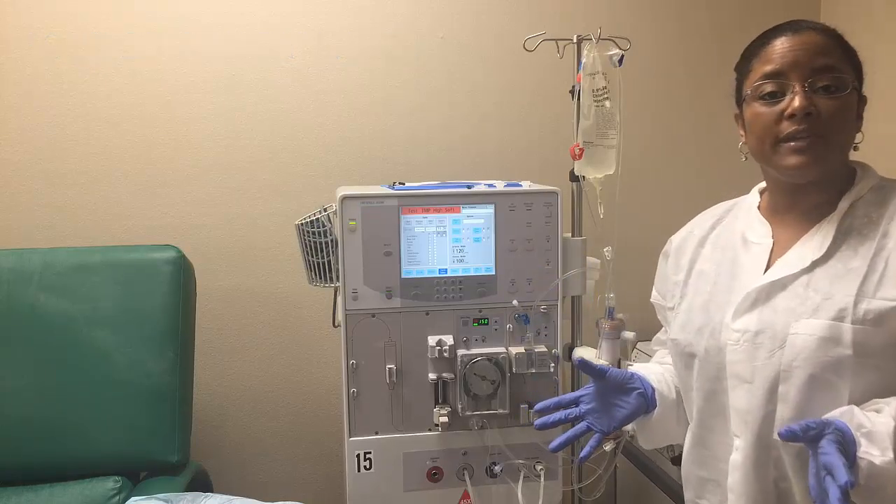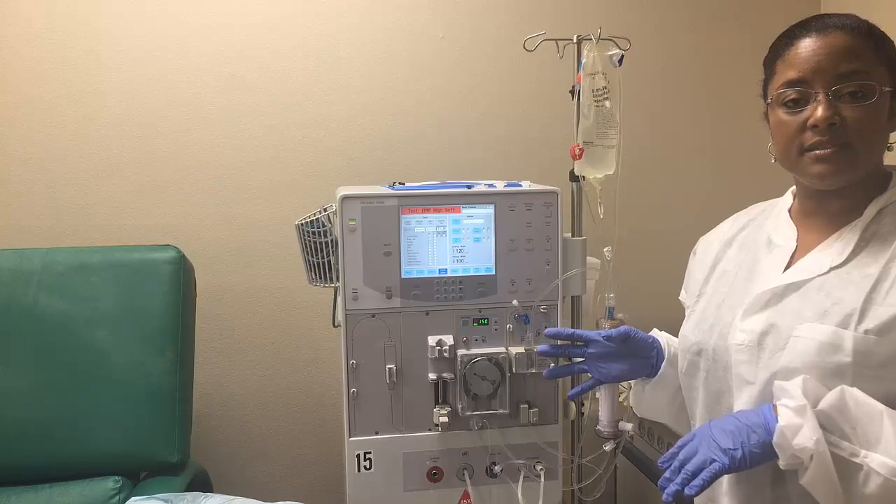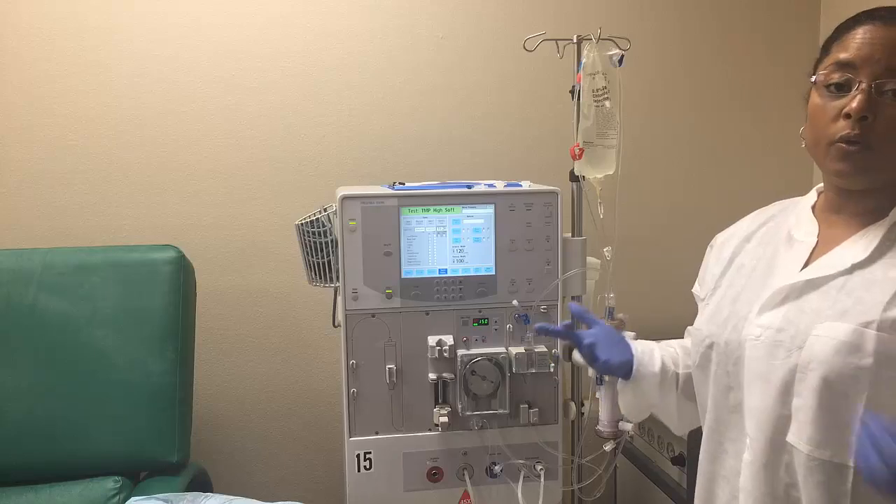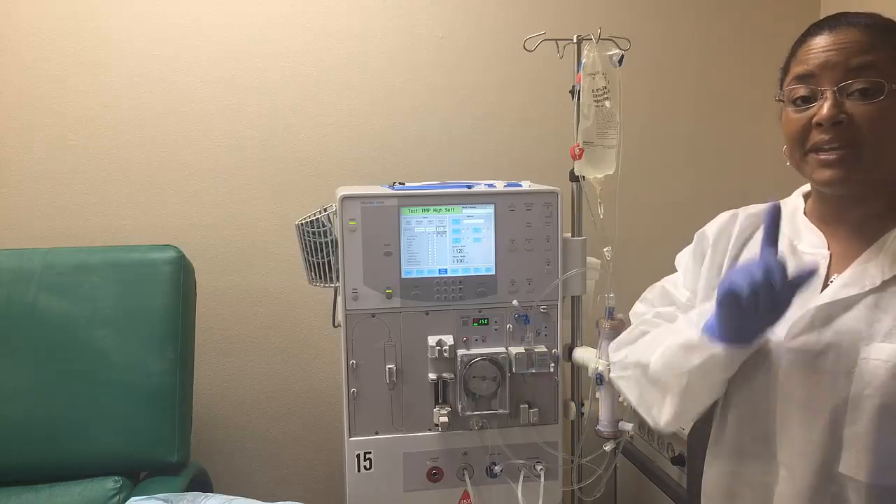So let's go ahead and wait until our alarm test is done. In the meantime, I can go ahead and start preparing other things, or cleaning, like cleaning my draining bucket.